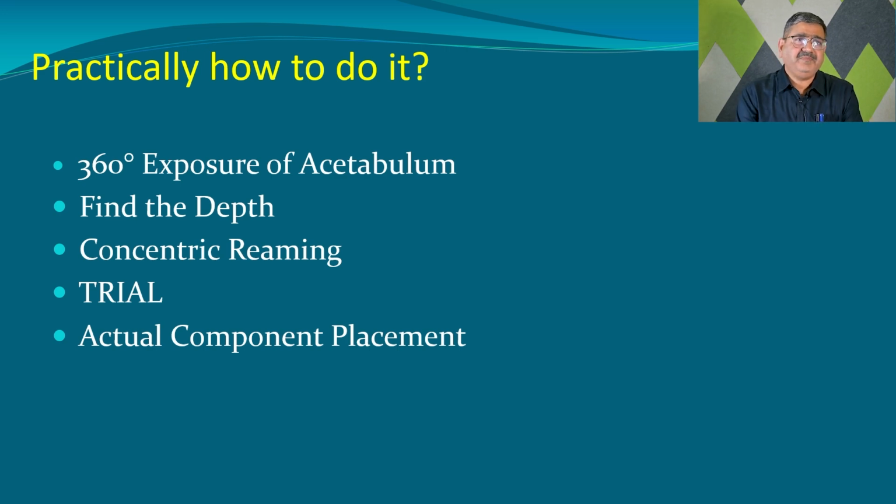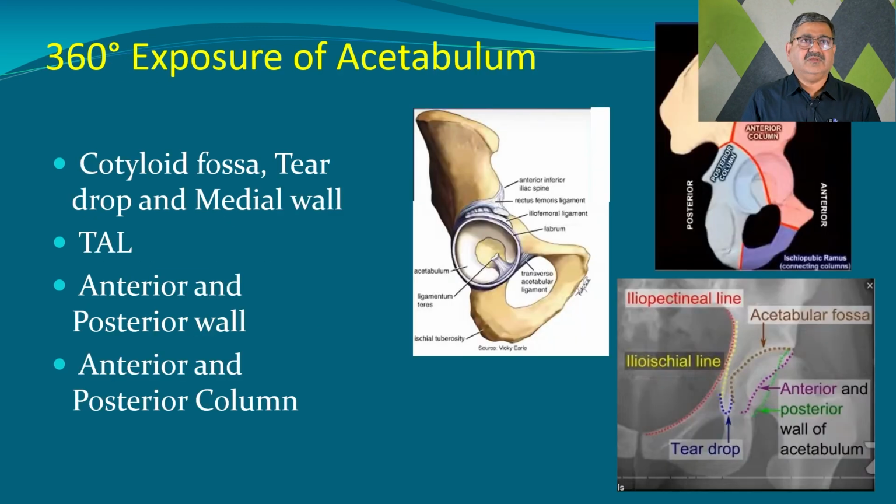Practically, how to do it? You must have a 360-degree exposure of the acetabulum. Find the exact depth, concentric reaming. You can do trials and then the actual cup positioning. So, 360-degree exposure of the acetabulum.